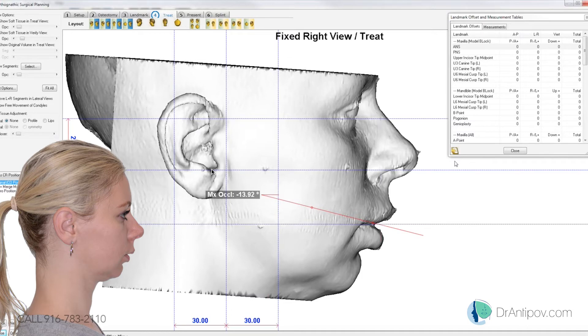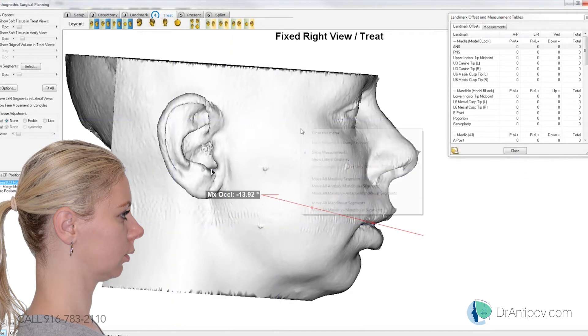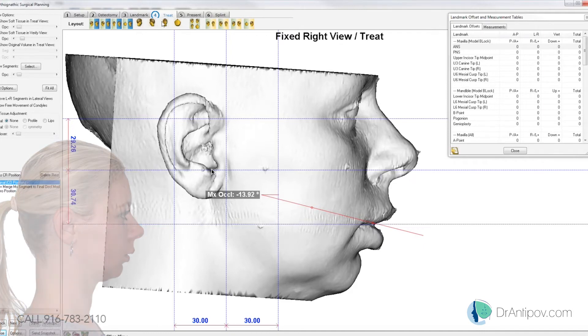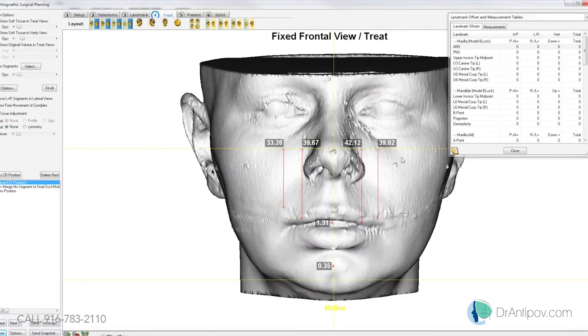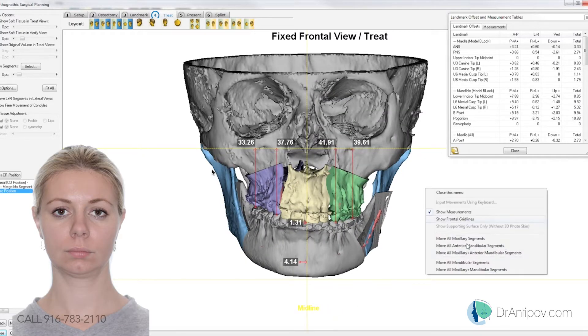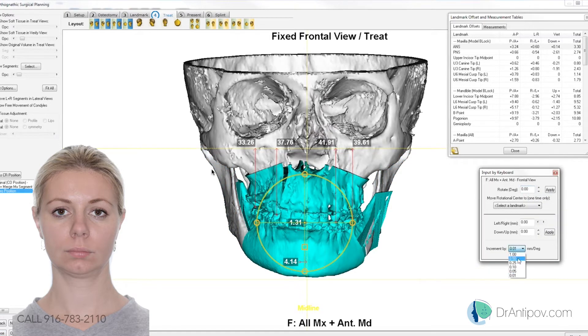Yeah, that looks about right. The Frankfort plane is about 13 degrees. I think that looks about right. So I'll come to the occlusion and go ahead and mark that cant and midline that we're seeing here.